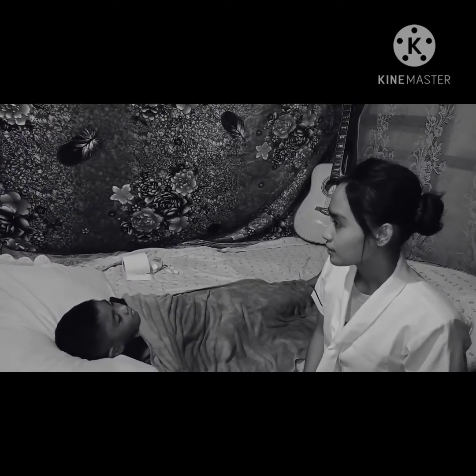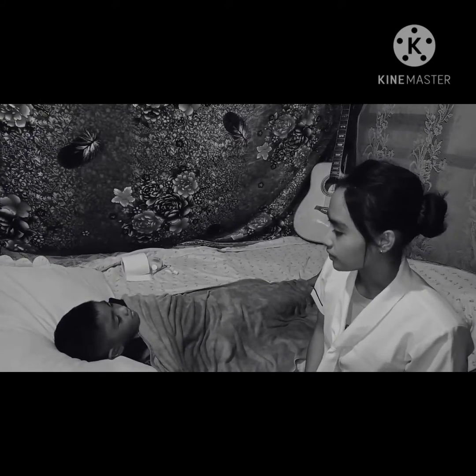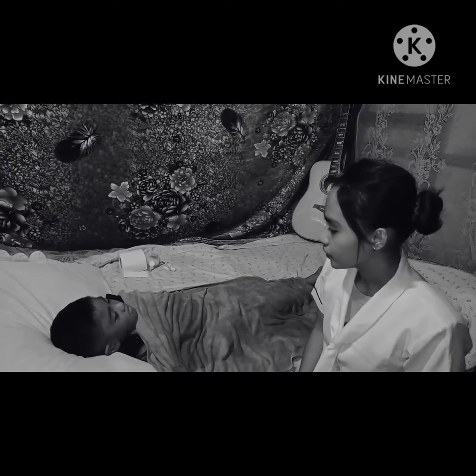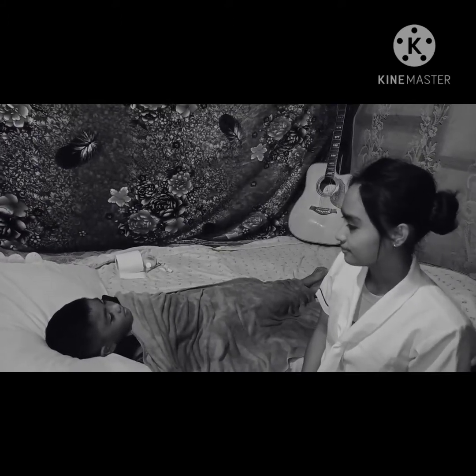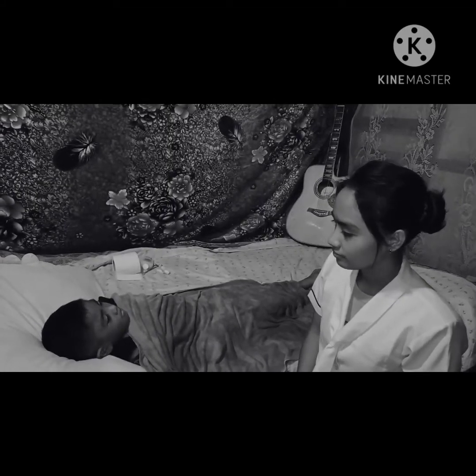Let me explain to you what a urine catheterization is. That means I am going to insert a tube through your urethra to reach your bladder in order to drain the urine from your bladder. Is that good? Any questions?